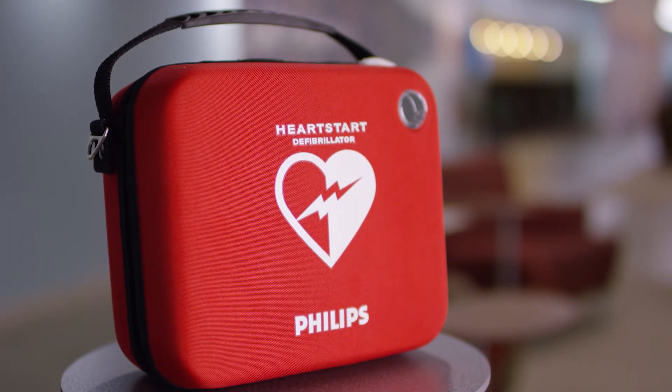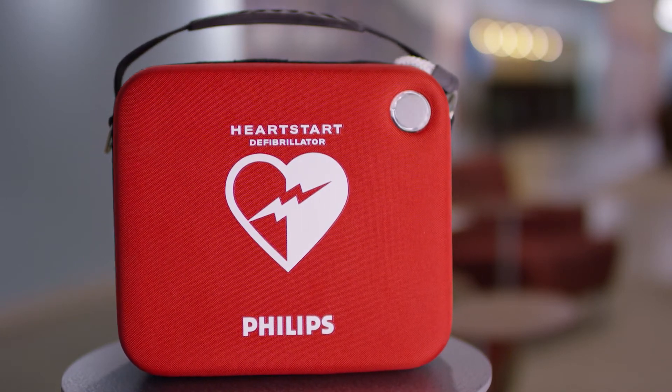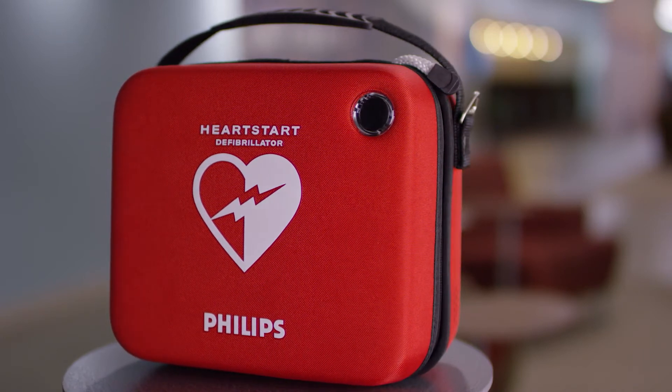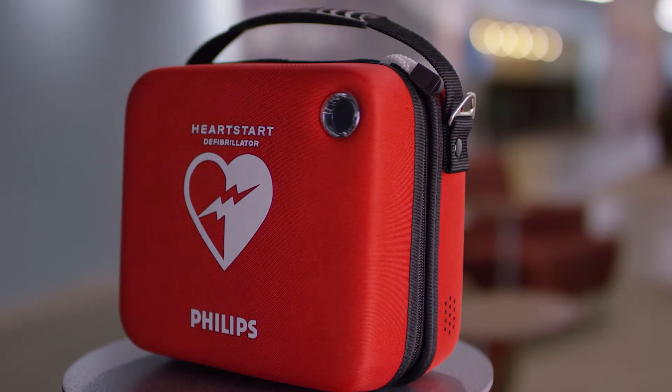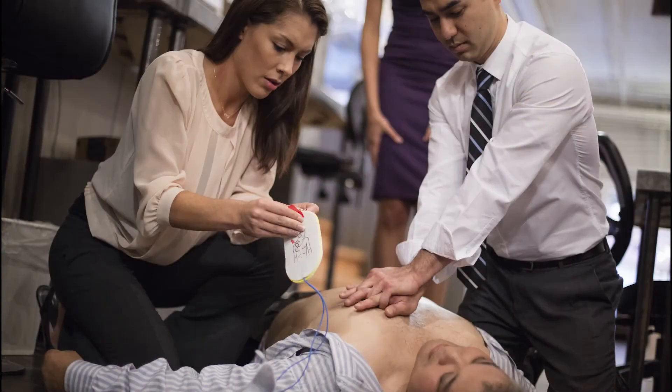Congratulations on your purchase of a Philips HeartStart OnSite AED. Designed for the ordinary person in the extraordinary moment, the Philips HeartStart OnSite Defibrillator is ready to act and virtually ready to go. Your HeartStart OnSite AED can help you save the life of someone suffering sudden cardiac arrest.